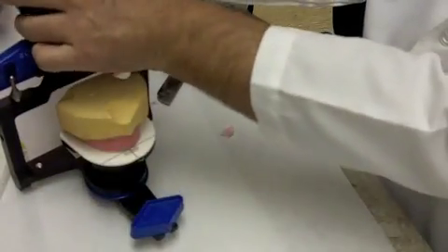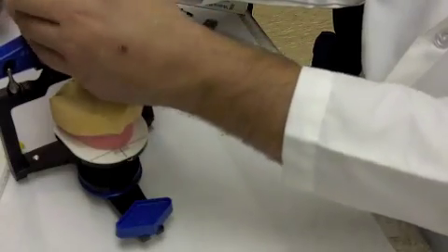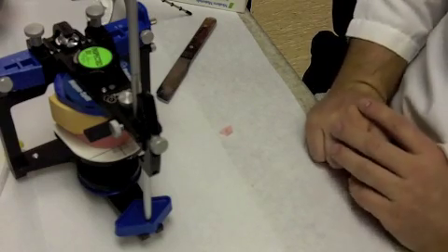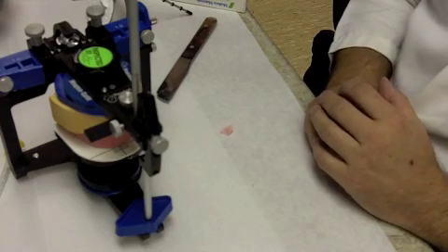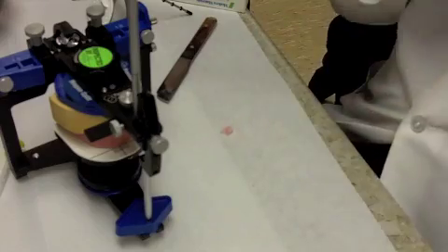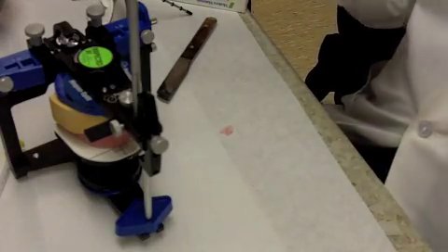Then you're ready to take a mounting plate, put it on the articulator, making sure your pin is at 0 and your pin that's set at 0 is actually touching the table, and then you can go ahead and mount the maxillary cast in this position. This is how we can use it for our simulated project.